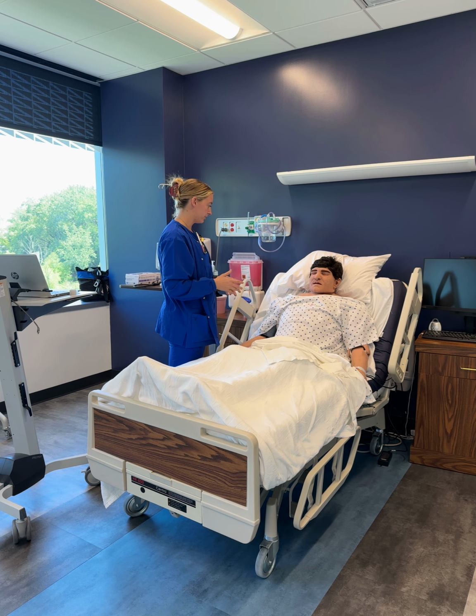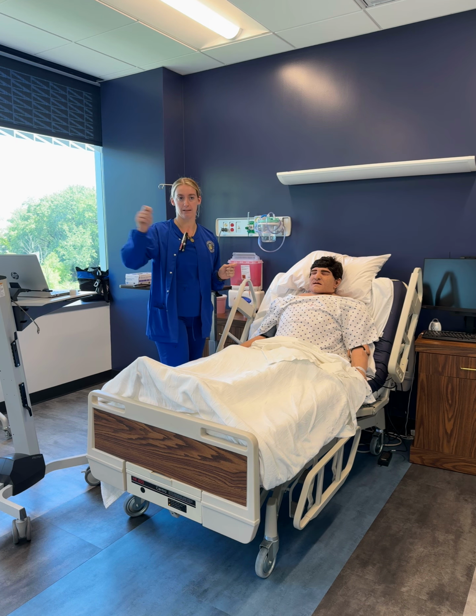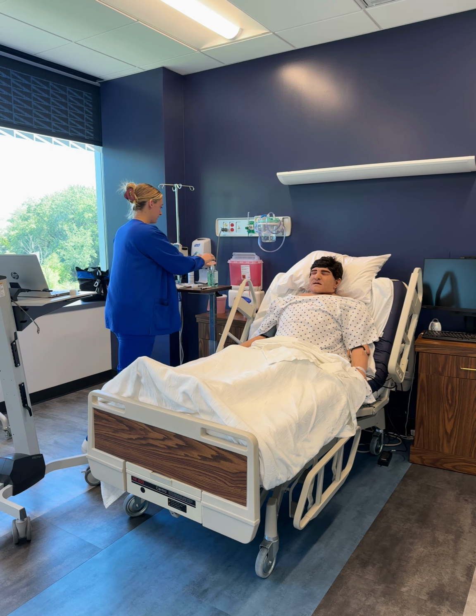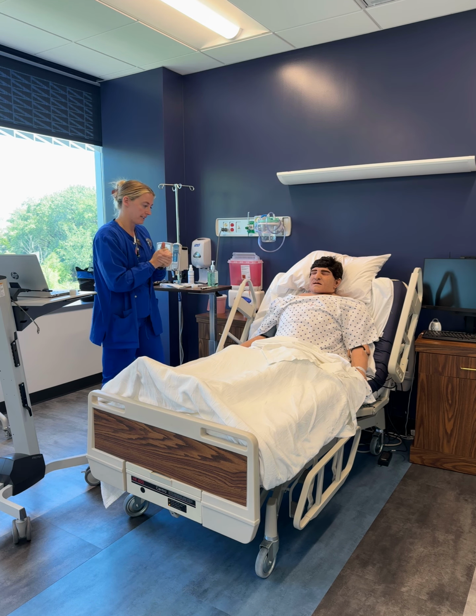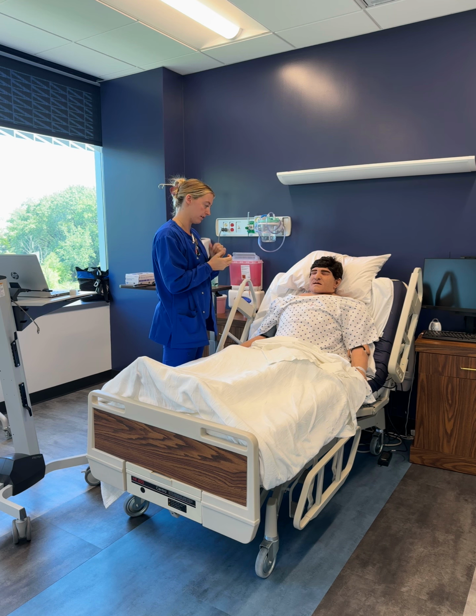Do you have any allergies? Patient says no. I'm going to provide privacy. I'm then going to perform hand hygiene. We're going to educate the patient on why they're getting an NG tube, which is for a bowel obstruction, to help resolve the bowel obstruction. We're going to ask if they have any questions.